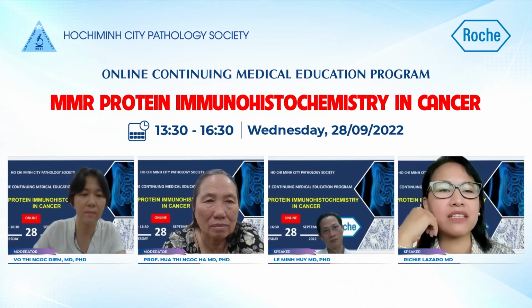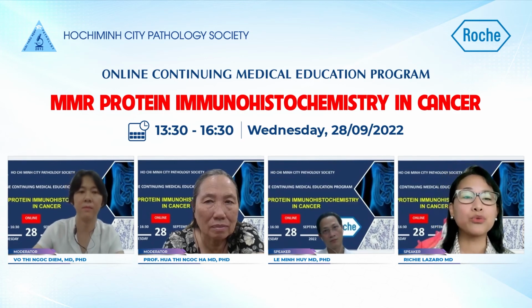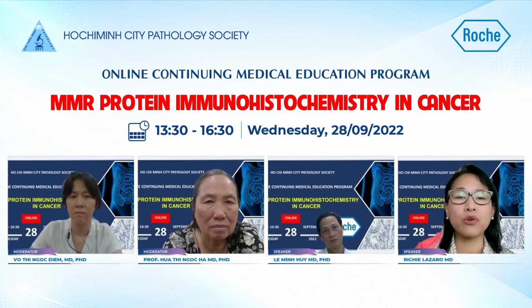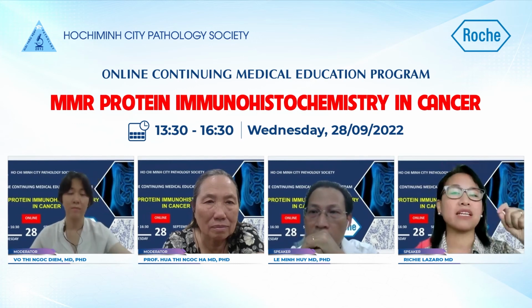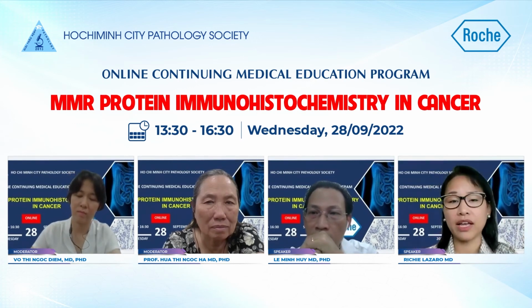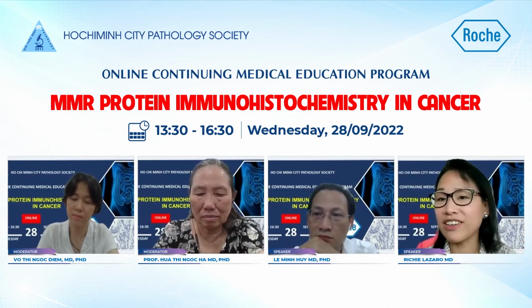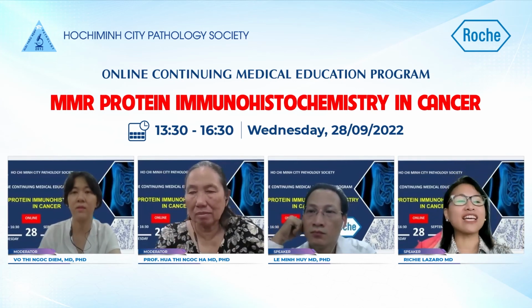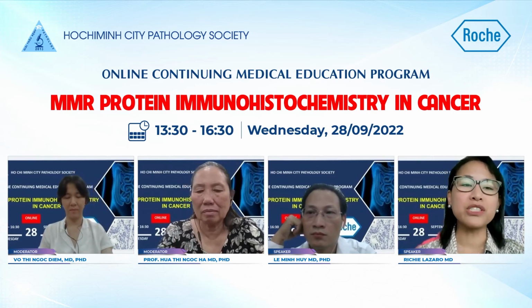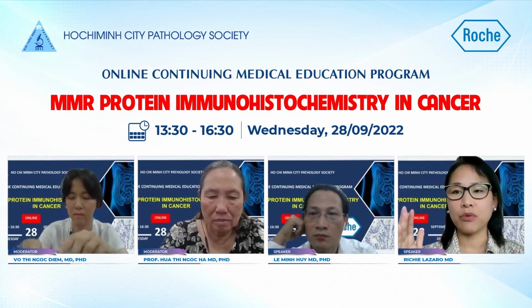Could you please advise on the pitfalls in case of cytoplasmic staining, where the tumor cell nucleus is strongly positive or weakly stained or not stained? If there is cytoplasmic staining, whether it's weak, moderate or even strong, and you saw pictures in my lecture of cytoplasmic staining, ignore the cytoplasm. Just focus on the tumor cell nucleus and compare it with the internal control, which is the stromal cell nuclei.